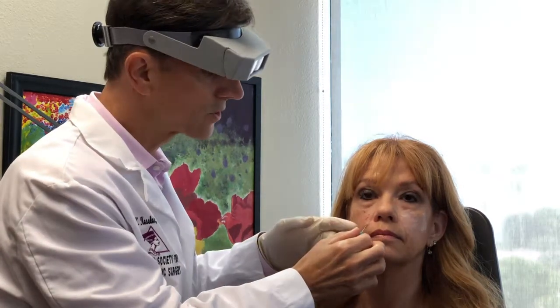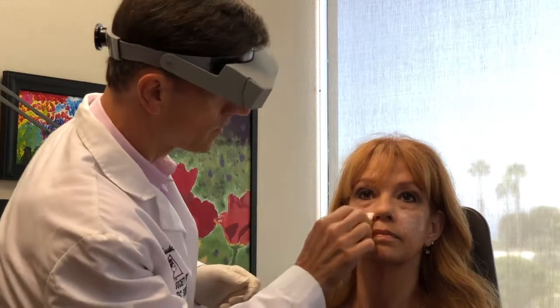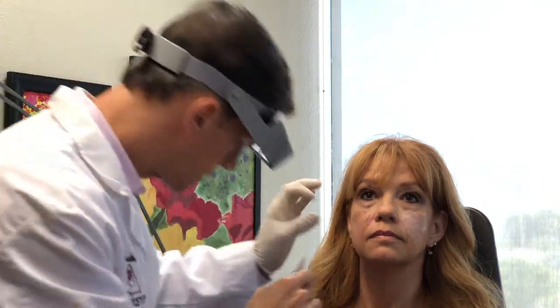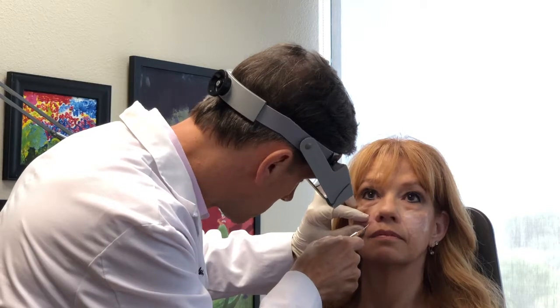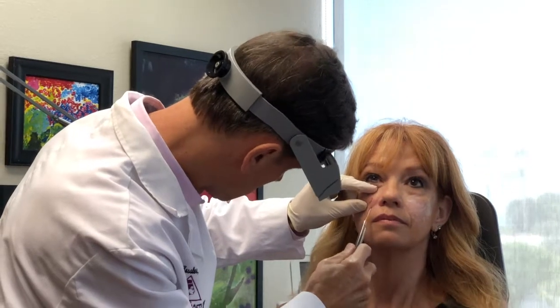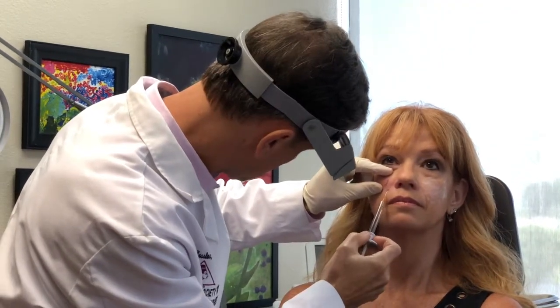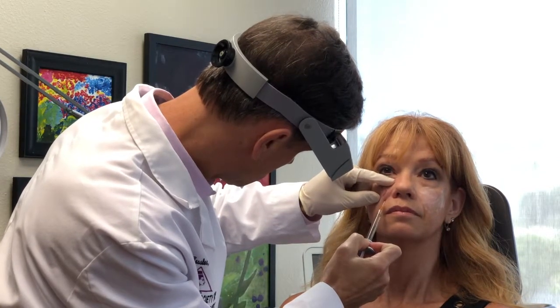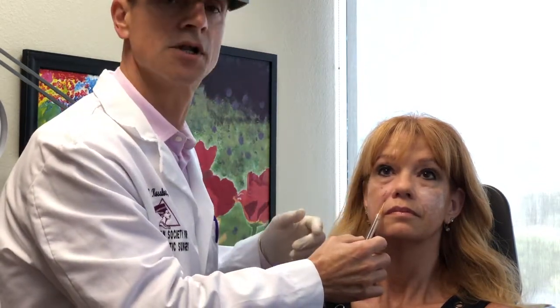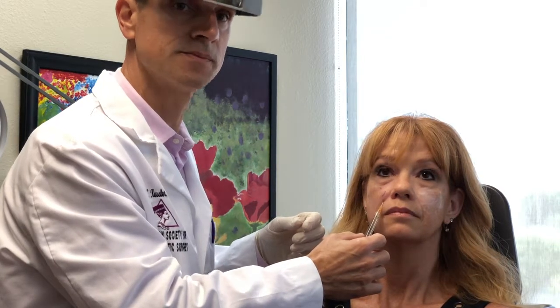I use a 25 gauge needle and 25 gauge cannula for these injections. First we introduce the needle to create the opening, and then the cannula is passed through the opening. We immediately go to the periosteal level and do an aspiration and small placement of the filler. All the while injecting, you are looking at the quality and color of the skin to see if there is any blanching taking place.